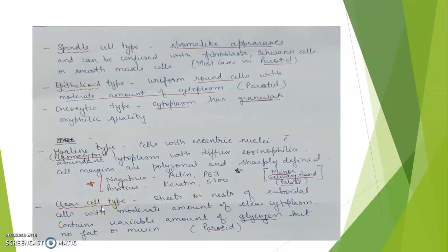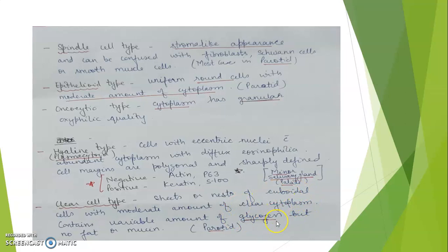In the clear cell type myoepithelioma, there are sheets or nests of cuboidal cells with a moderate amount of clear cytoplasm. The clear cytoplasm contains a variable amount of glycogen — the cytoplasm is clear due to glycogen, not fat or mucin. The clear cell type is also found in the parotid gland.